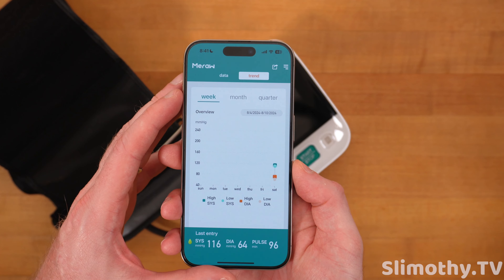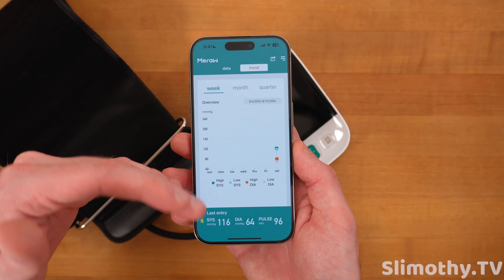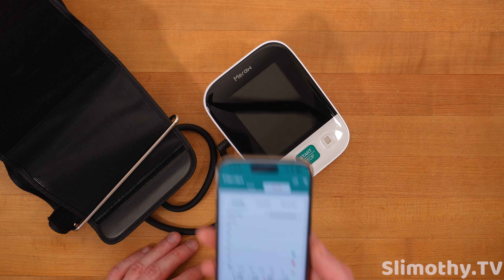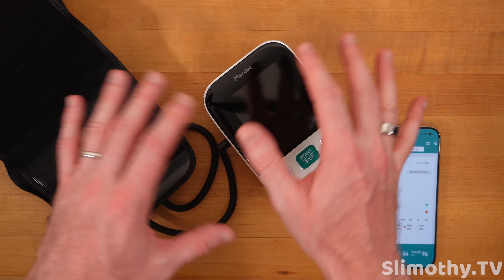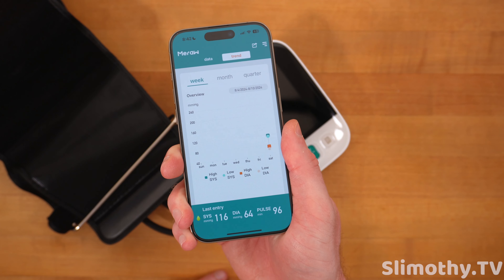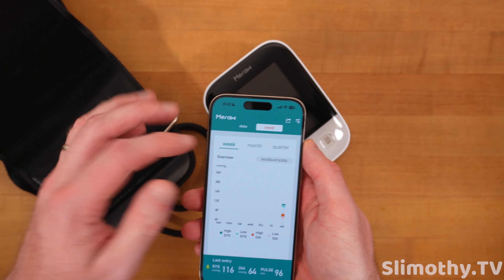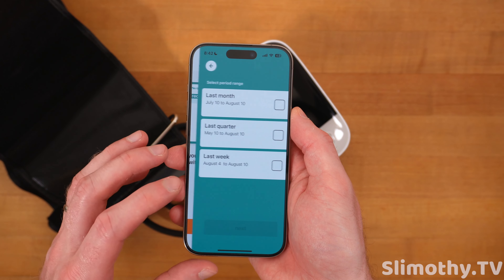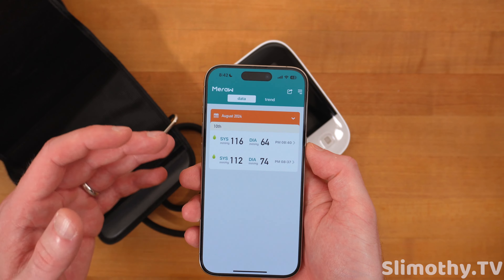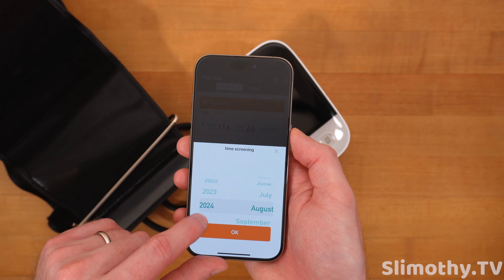You can click on Trend to see a graph. If you're taking readings every day — say you have high blood pressure — this is helpful to spot trends. Even if the readings are off by 10 or 20 points, you'll see when it goes up and down. You can view by week, month, or quarter, share the data, download it, and select a custom time range. It's a very simple but clean app.